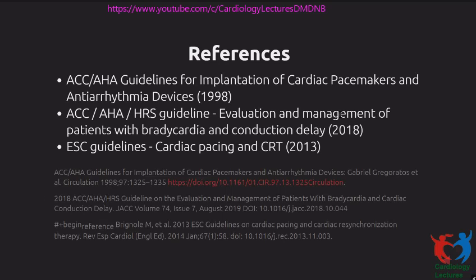Now the additional complicated question here is whether you should implant an ICD also. I would probably say no. There's no strong evidence on this. Definitely physiologic pacing, because otherwise they're going to do worse. Implantation of a defibrillator would have to be decided in consultation with the patient.